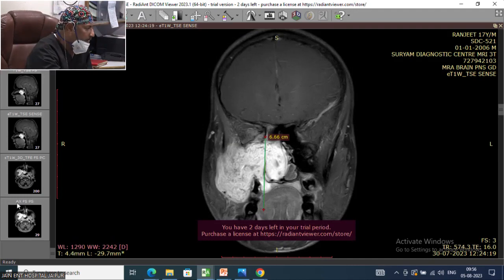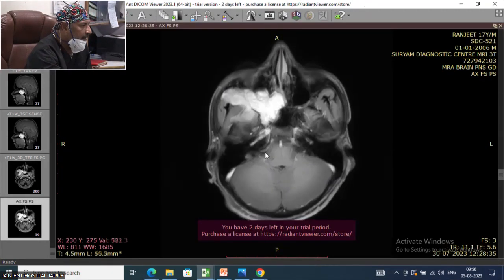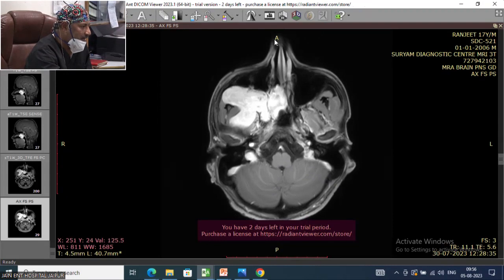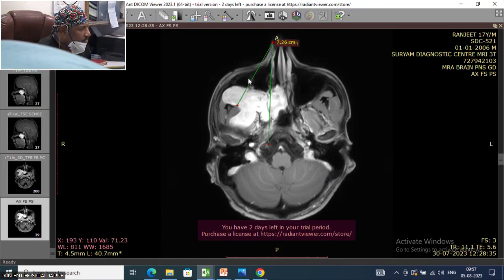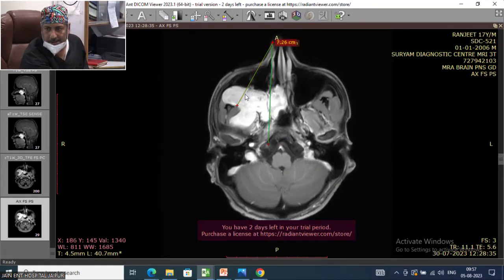We need to have a good exposure. I'll take a good far lateral exposure. See, this is my lateral wall of the maxilla, nasal cavity. And what I'll do to catch here, I will remove this much of the bone here. This much of the anterolateral wall to give me full exposure of this region. This part I can pull out later on. Okay? So this exposure will allow me the opportunity to take this vessel over here.